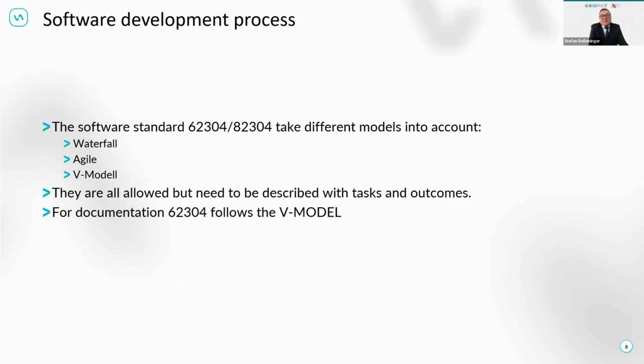you will always have some kind of an agile system. So you will create first requirements. Maybe you have a set of user requirements and use cases already available. Then you will create a set of requirements. With that set of requirements, you will go into the architecture. You will create the code. You will create the product. You will look into the verification and see, yes, that's good. And then you add additional requirements.